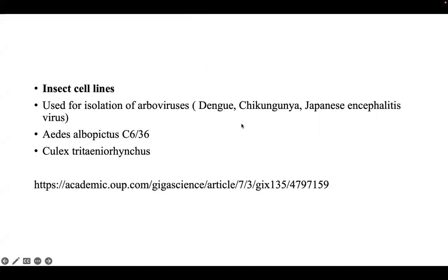Can the cultured viruses be stored at an inactivation temperature the way bacteria cultures can be preserved? An example is the shell vials. The shell vials are just manufactured and you buy them. You buy the cell cultures that are already prepared.